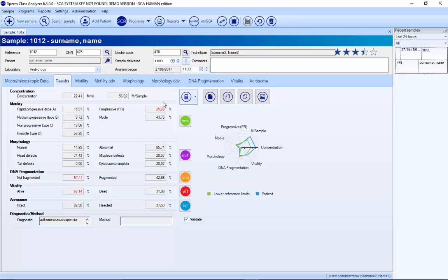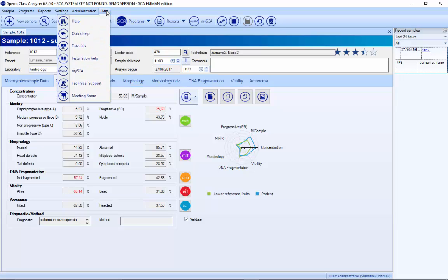Finally, there is a help section with tutorials for each characteristic showing how to do it. There is also a technical support button that, when pressed, connects automatically with Microptics so we can do online support and check everything. And there is a meeting room where we can do demos, trainings, and online trainings.